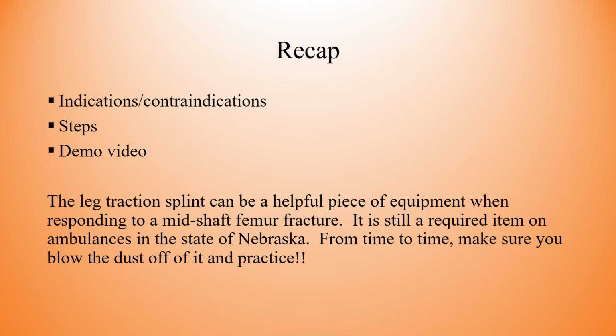So the leg traction splint can be a helpful piece of equipment when you respond to a midshaft femur fracture. Also keep in mind it is still a required item on ambulances in the state of Nebraska. So what I like to tell people is from time to time, make sure you blow the dust off of it and practice.